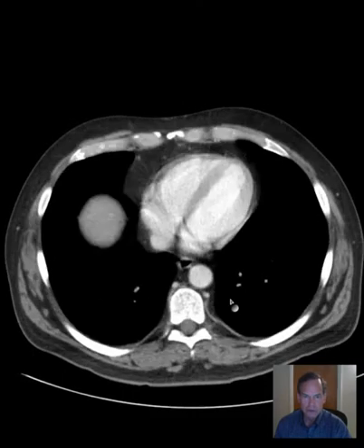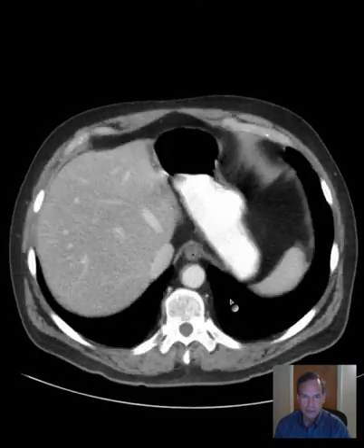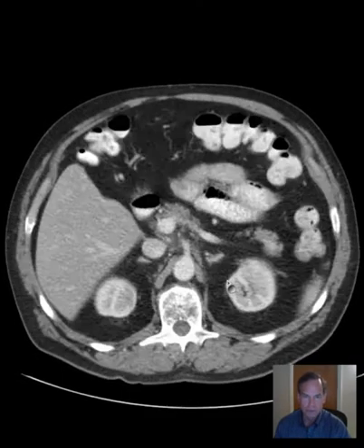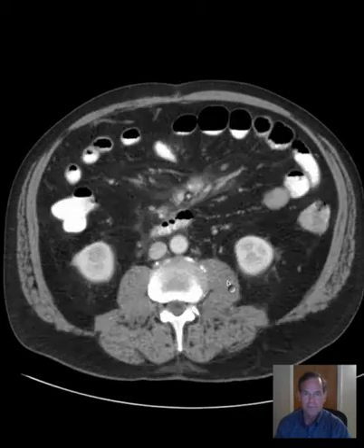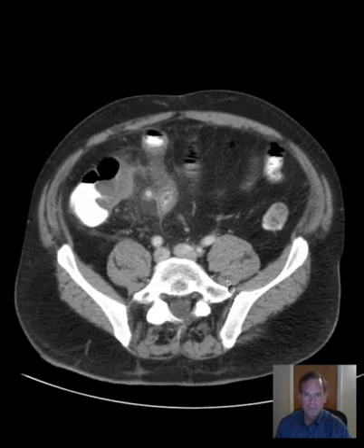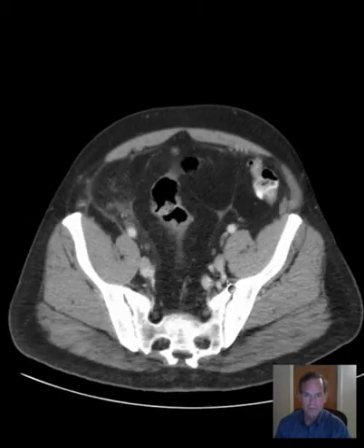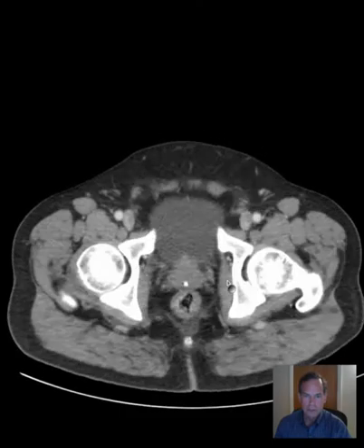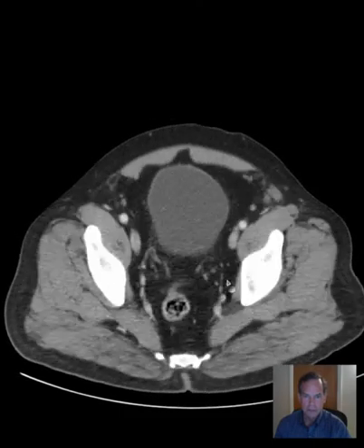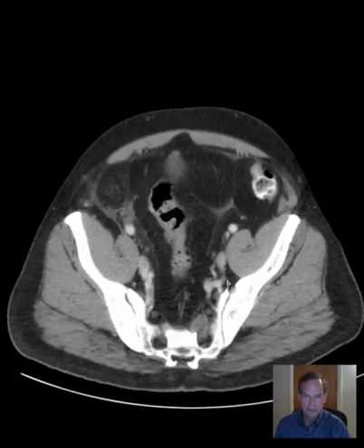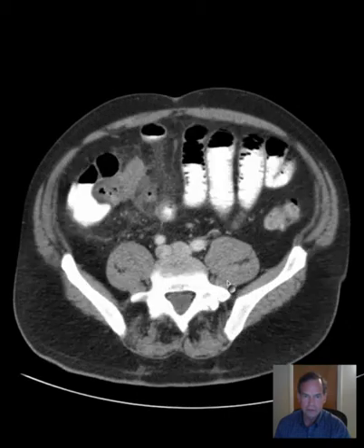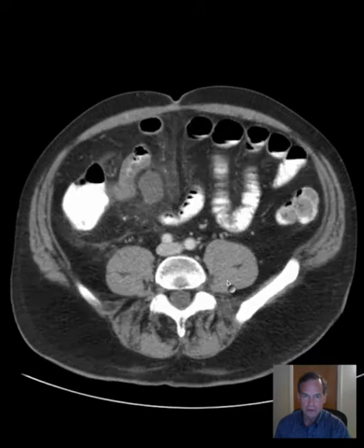I'll give you a chance to look over the axial images and get an overview of what we have here. And then back up just to look again a little more carefully now that you know that there are some abnormalities here.